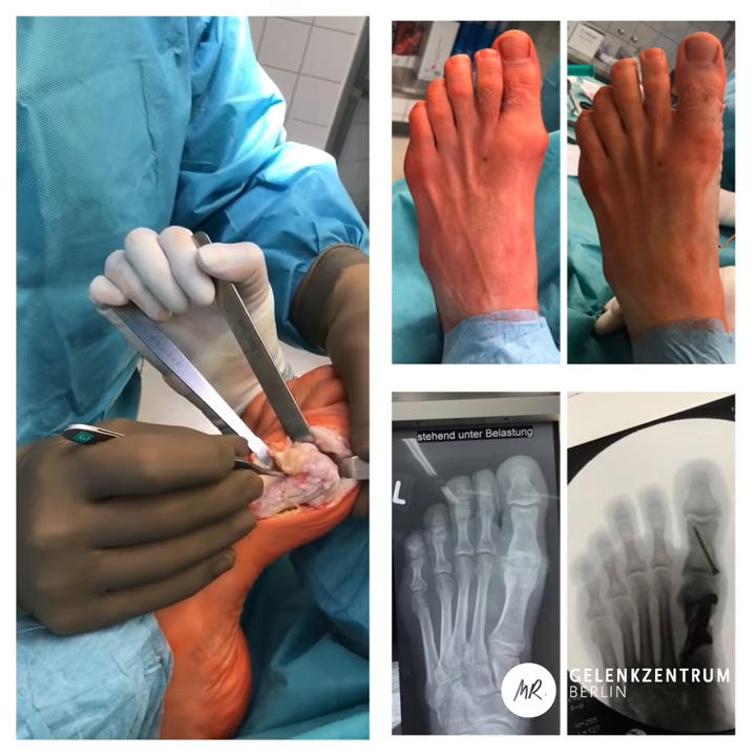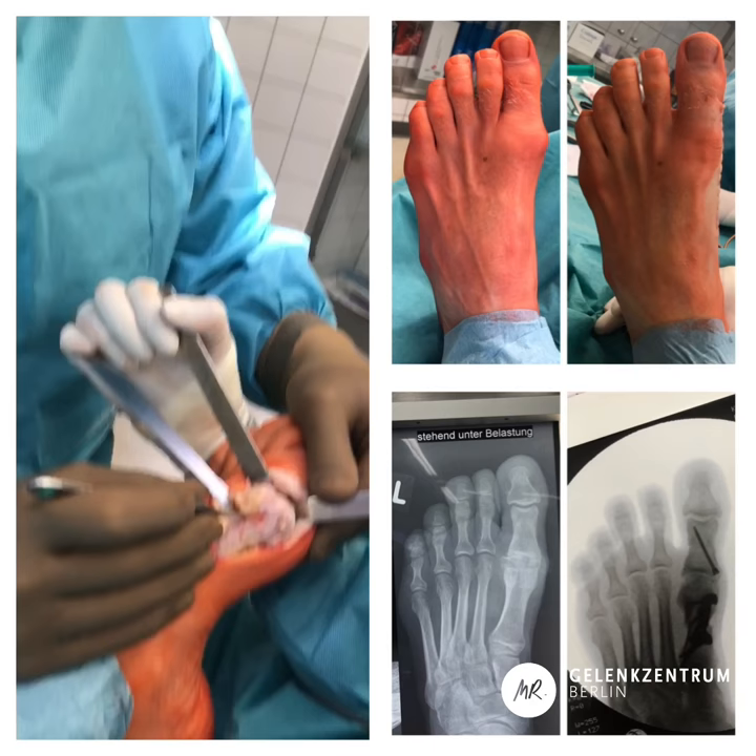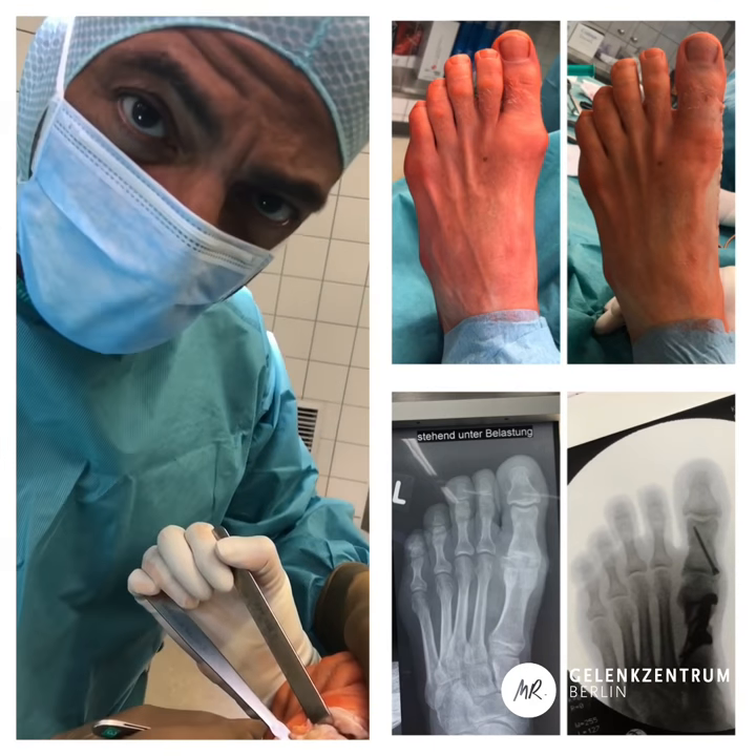Usually patients like this are always being fused, but it's not necessary.